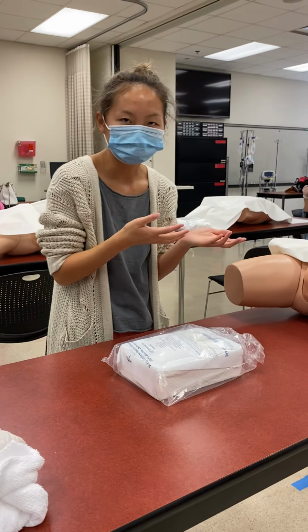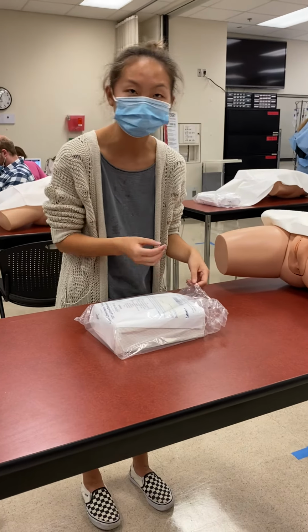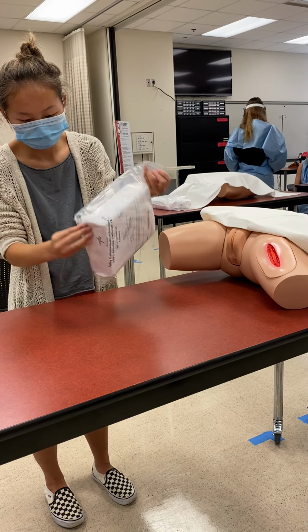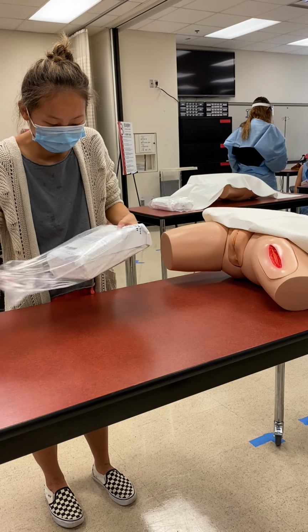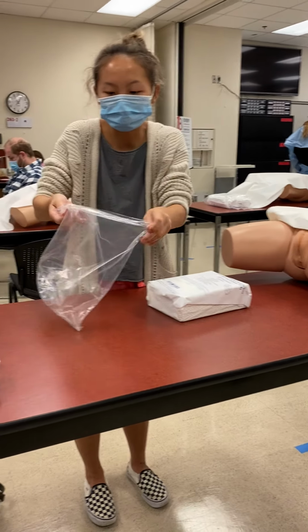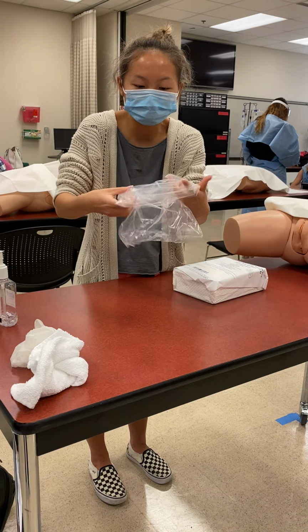So now that we have the person set up, I got my Foley catheter kit, and now we can open this up and get ready. And so we want to use this as our garbage disposal for any of the excess waste that we make in the process.